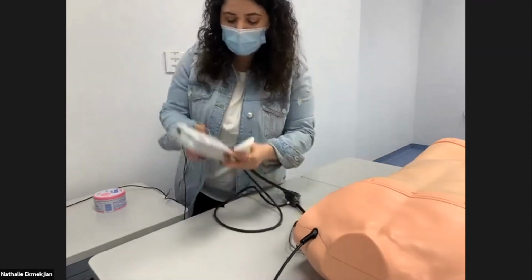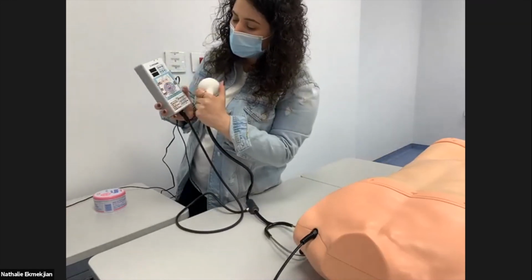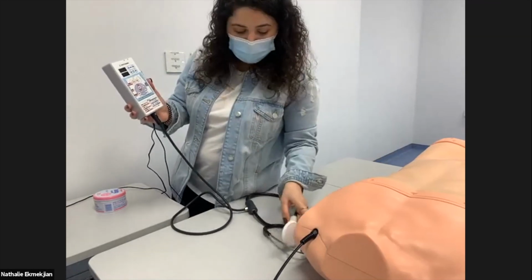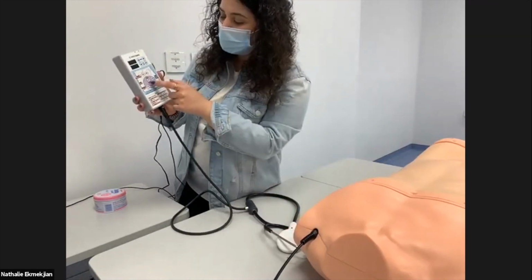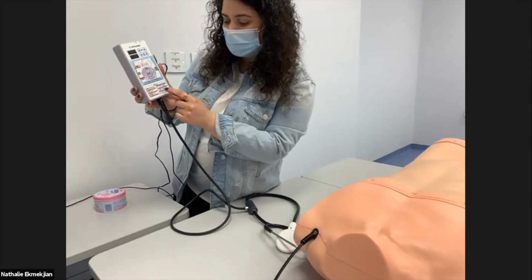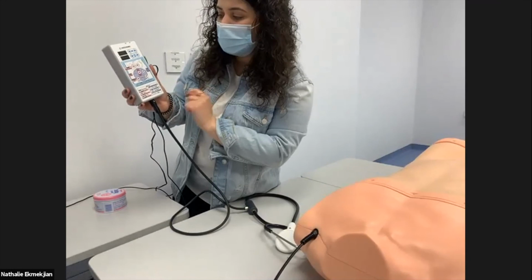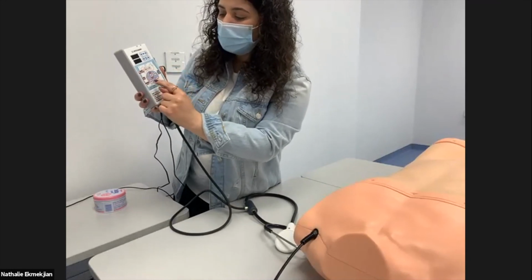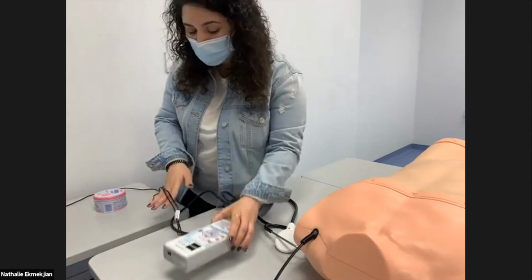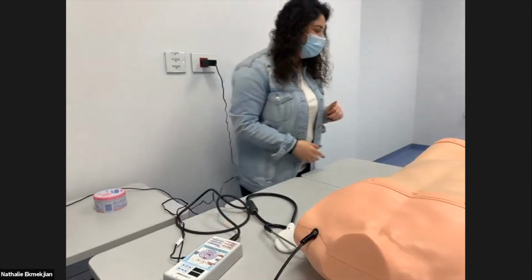And the same thing will be applied for the renal artery, aorta, and CIA. Okay, just something to note that for the bowel, we have the normal and 4 cases: increased, decreased, obstruction, and ileus. For the renal artery, aorta, and CIA, we have the normal sounds. Any questions?